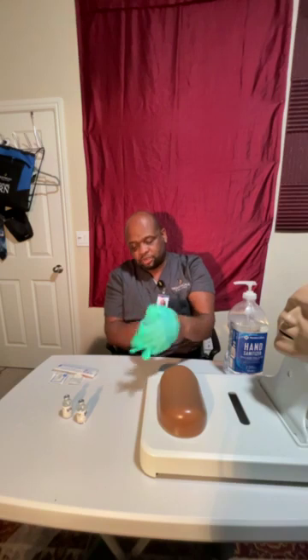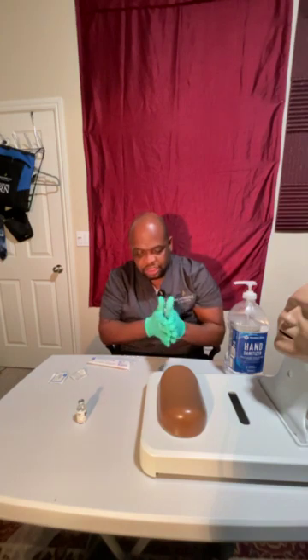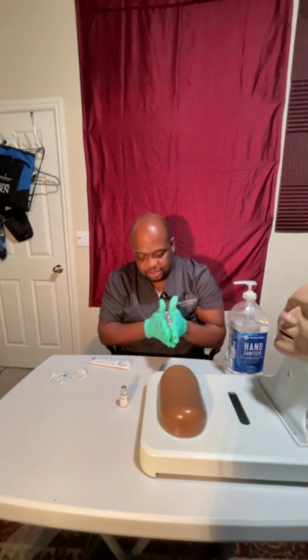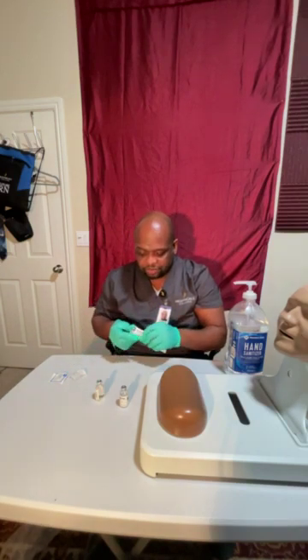Since Nurse Agnes is here, first things first, I am not going to shake the insulin, but I'm going to roll it in my hands, just to make sure that it's properly mixed. I'm not going to shake it, just gently roll it. Okay, good. Now that I've rolled those, I'm going to go ahead and open up my syringe.